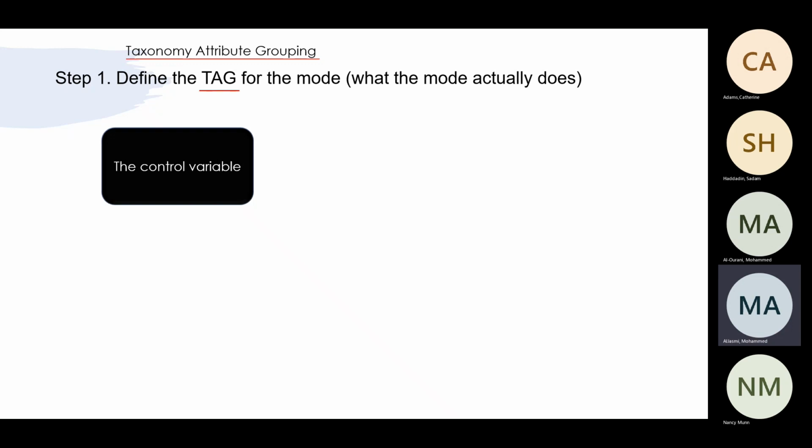Why are there these two types of physician? The first one will prolong the days of mechanical ventilation. The first one will prolong the days in the hospital. The first one will put the patient at more risk of pneumonia and complications from the mechanical ventilation while in the hospital. The second one will do his best to get out of this. However, sometimes even when I stop and do everything I cannot get out of it, then I need to paralyze the patient, but I have done everything that I can do.